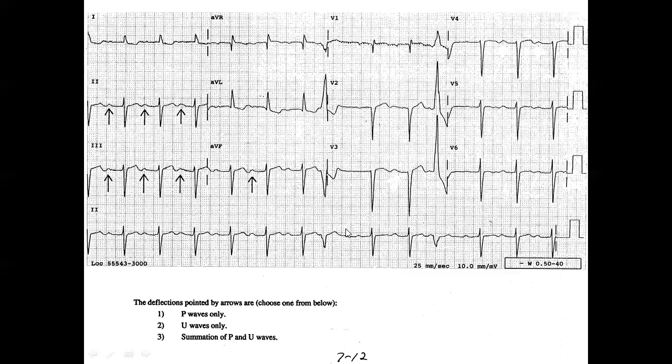So many times the compensatory pause after the PVC can be very useful. So make good use of it. You might say, oh, who cares? Oh yeah, it's very important. If this is a patient that you are treating for infective endocarditis of the aortic valve, until yesterday PR was normal, but today PR is long. That could be the first or the only sign of paravalvular abscess. The patient may not feel any different, but this could be the first or only sign of paravalvular abscess, which is a surgical entity.